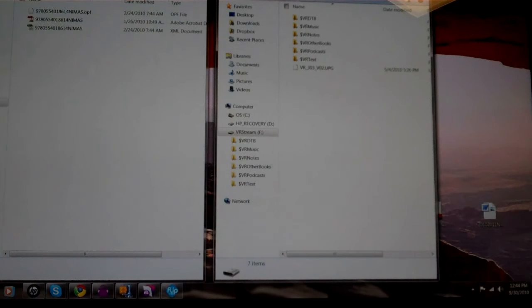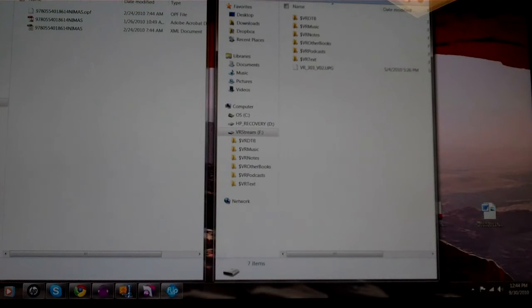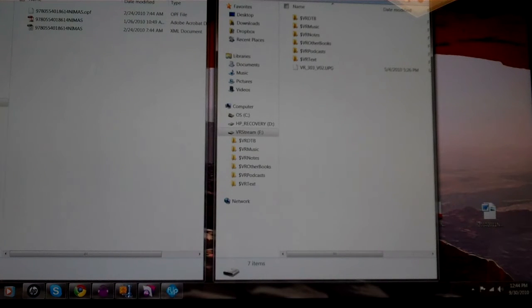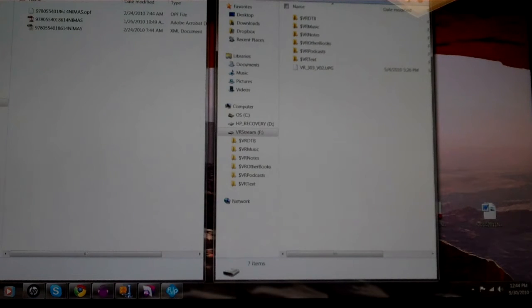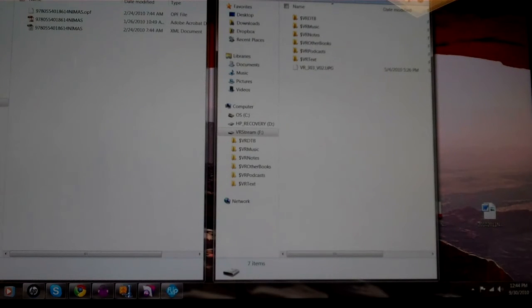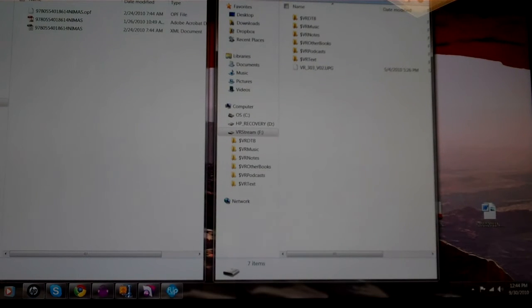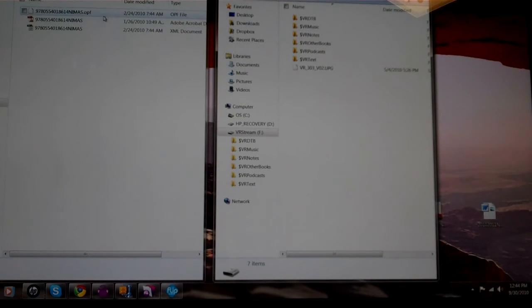Once you have your Victor Reader stream all updated, then you're ready to put your NIMAS file onto it. So what you'll do is take the card out of your Victor Reader and put it into your computer through a card reader or if your computer has a card reader built-in.